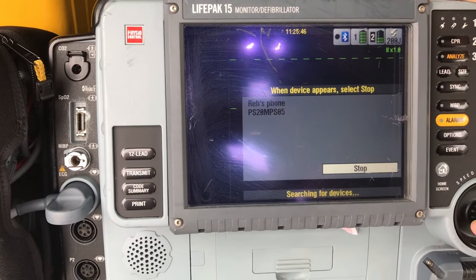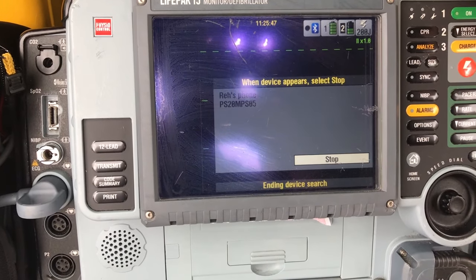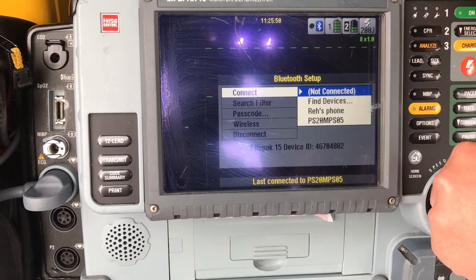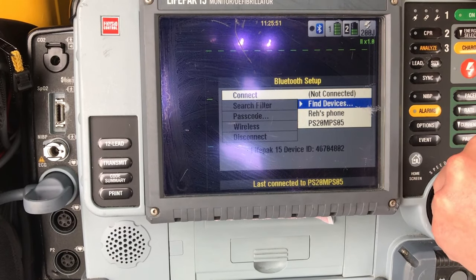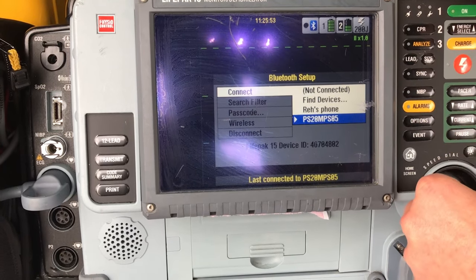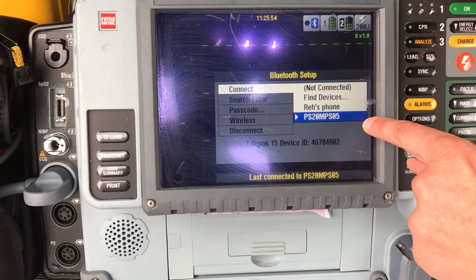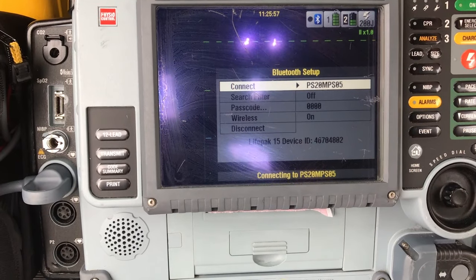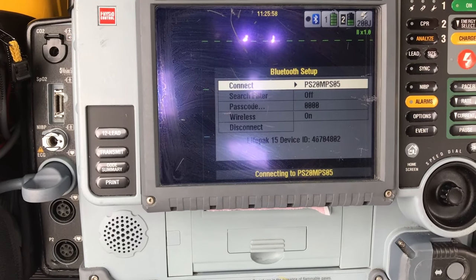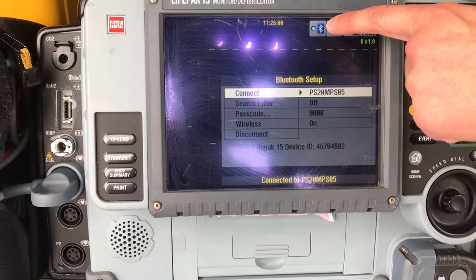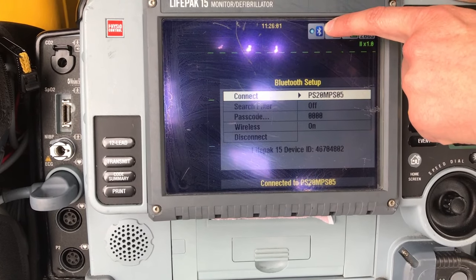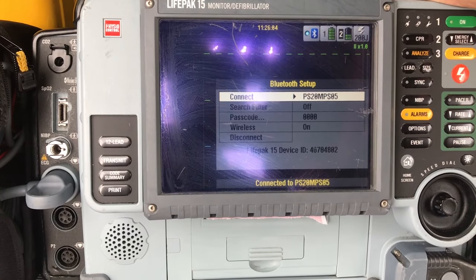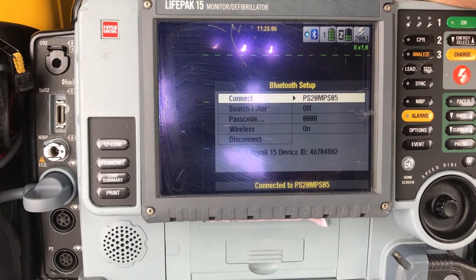When your device appears, select stop. Then it will be there for you to select. Come into the 05, highlight and select it for connection. When that blue light is illuminated, you know you're connected and you can download to the Toughbook.